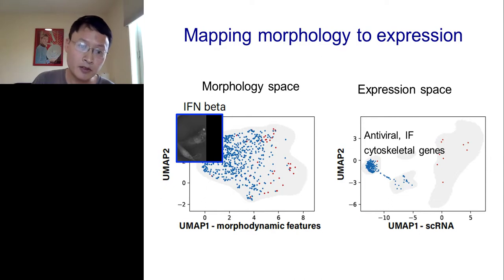And I think that's really one of the really exciting directions going forward, that with these computer vision technologies, as we've seen in both examples, we can learn powerful features to represent the spatial and temporal dynamics of the cells. And then we can actually connect that to rich information from the expressions, either from spatial transcriptomics or from single-cell RNA sequencing.